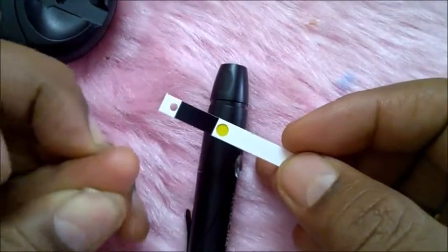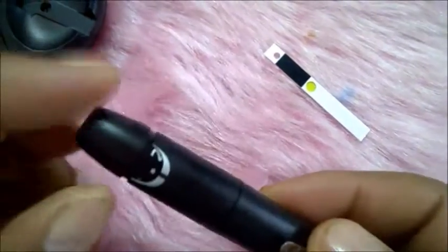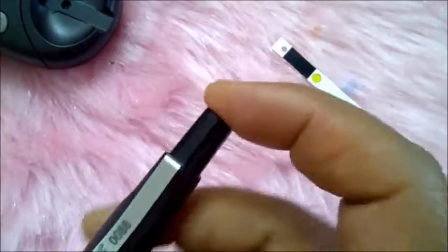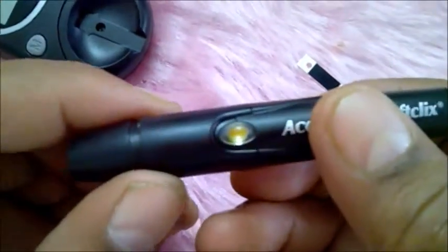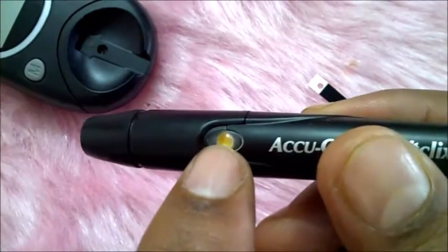Before using, you can see this is yellow — this shows it is in proper condition. This is the strip. Now I will take out blood for testing. I've kept it on 1.5 because my skin is a little bit hard. I press this and get a yellow display on this button, which means it is properly set.